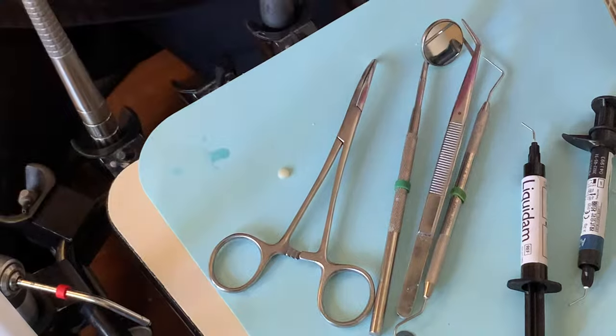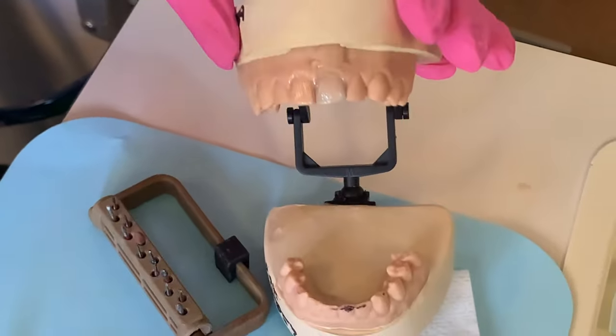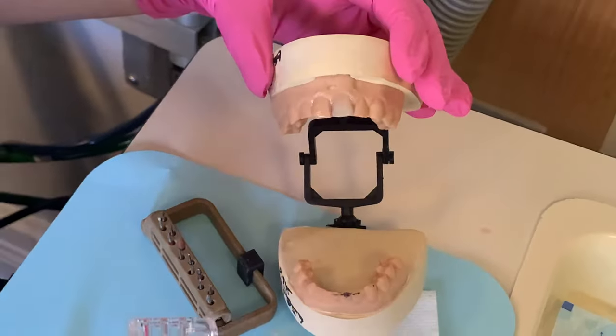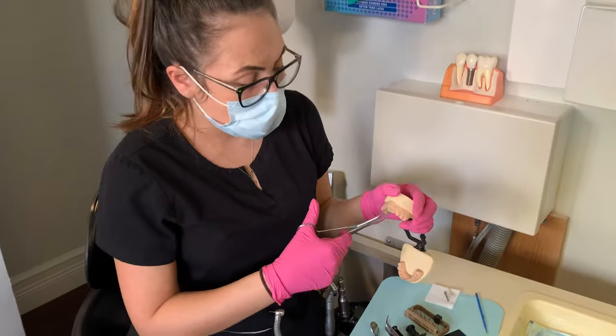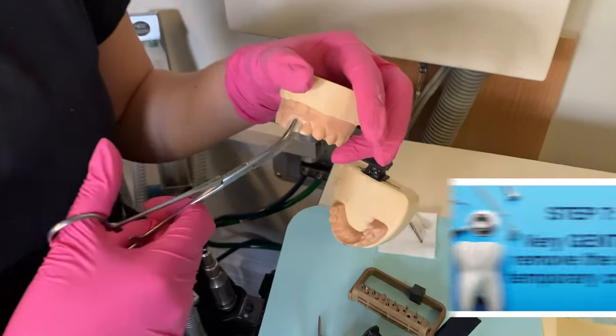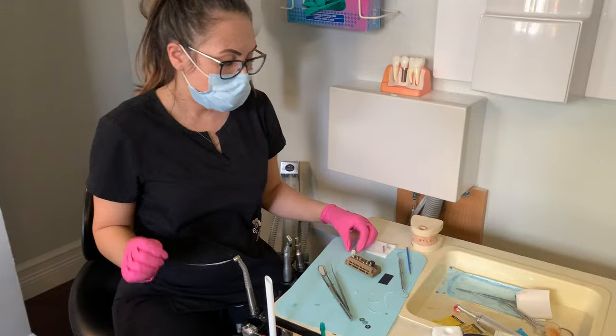Go ahead and remove the temporary — that's what it looks like. Sometimes it comes out on the impression, sometimes it stays stuck on the tooth. When you're ready to remove your temporary, you're going to grab your hemostat and wiggle it off just like that.